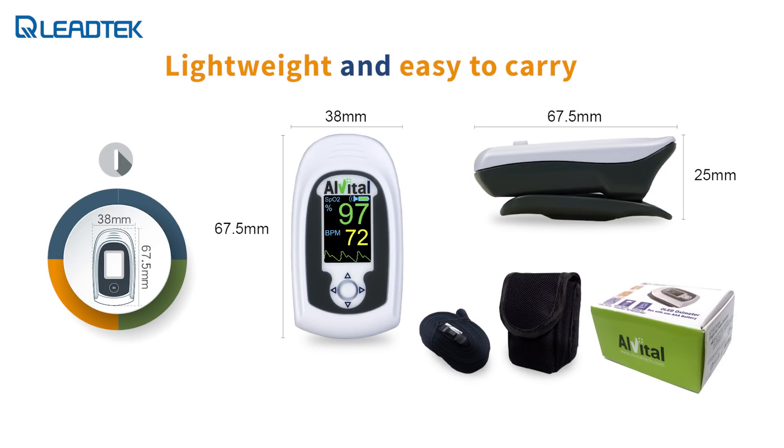The AT101 is extremely lightweight, which makes it easier to wear on the fingertip. The product comes with a set of user instructions, a lanyard, and a belt pouch. The belt pouch is an optional accessory.